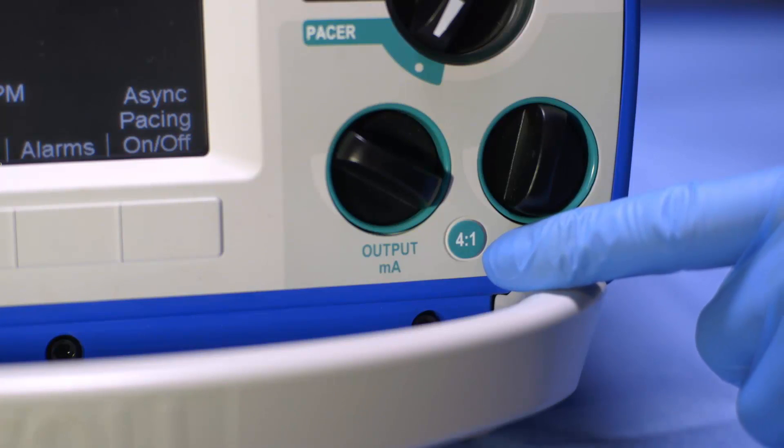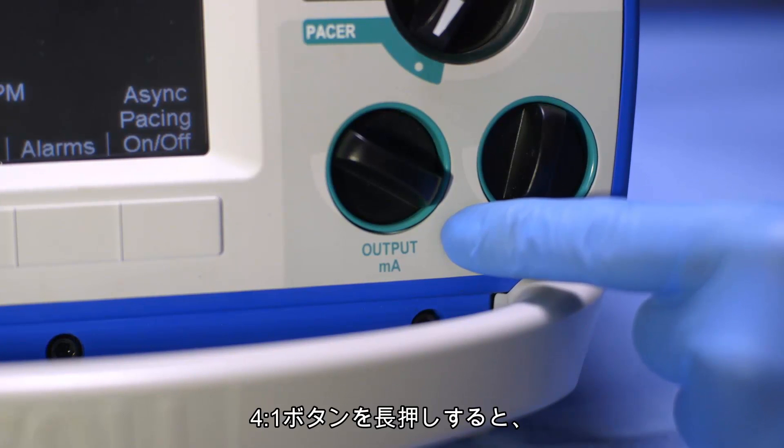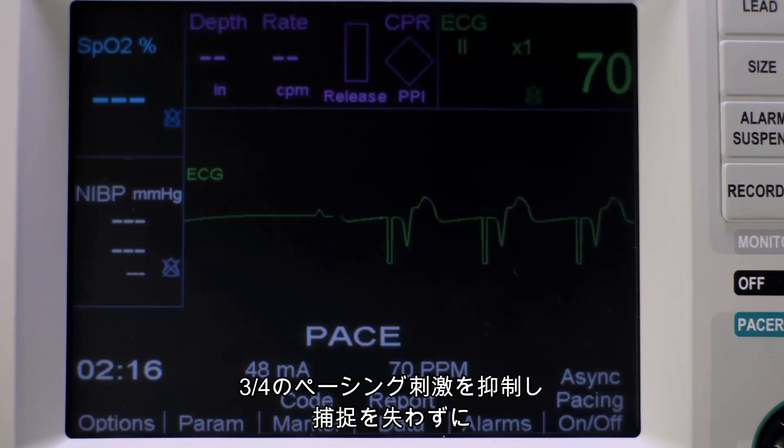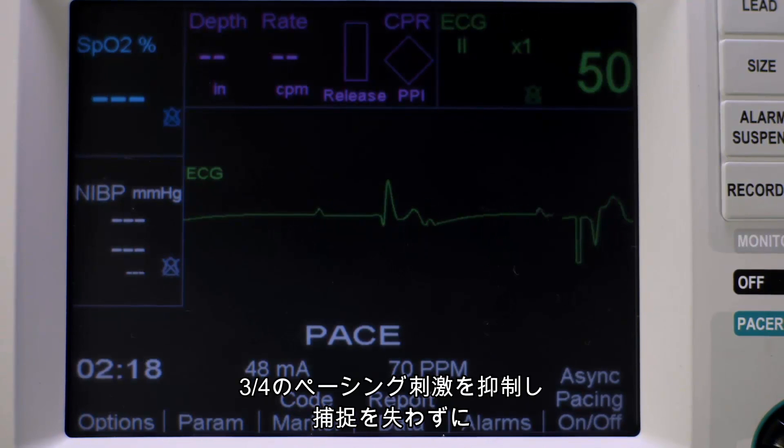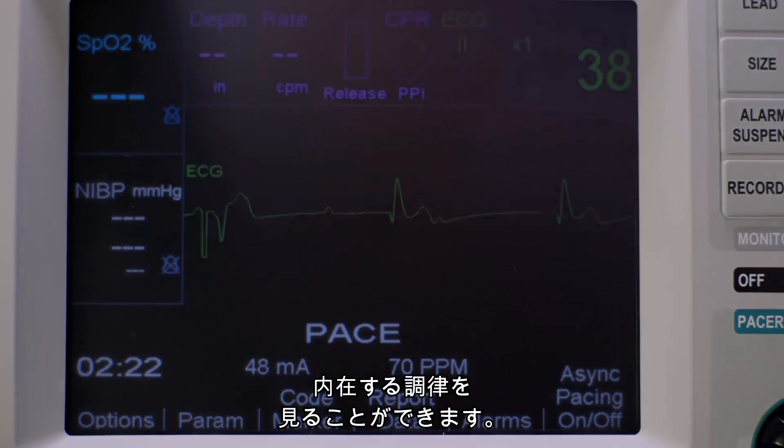At any time during pacing, you can use the 4-to-1 button to determine the patient's underlying rhythm. Press and hold the 4-to-1 button. This suppresses three of four pacer impulses to visualize the underlying rhythm without losing capture.